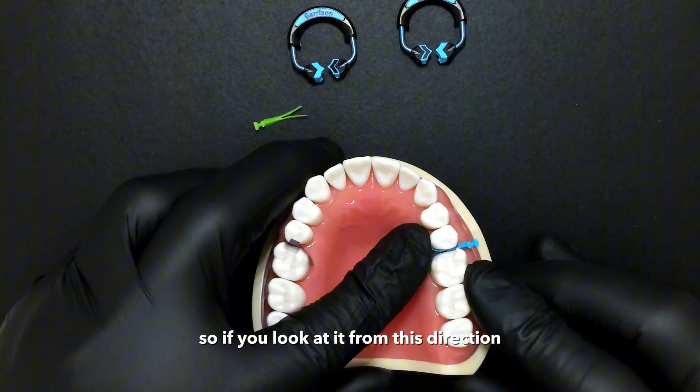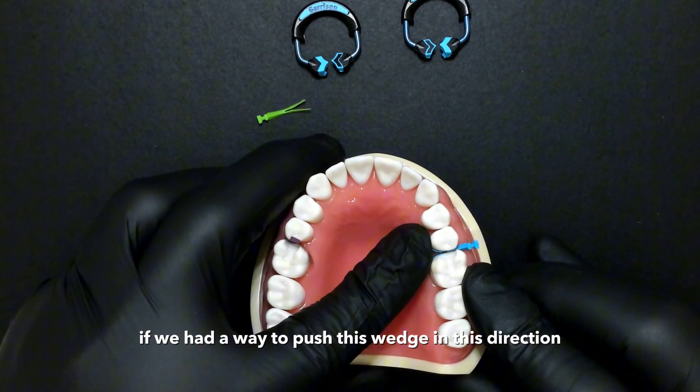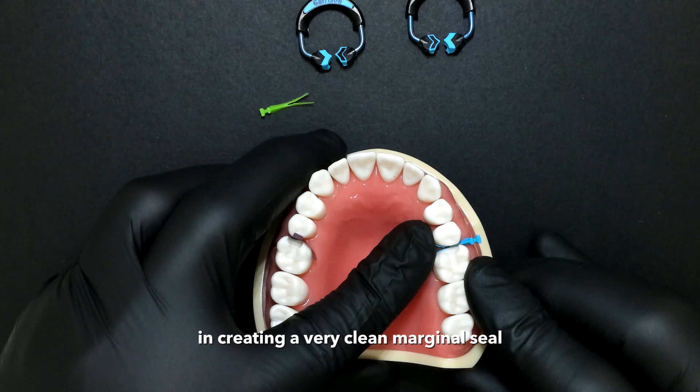So if you look at it from this direction, when I'm just pushing my finger against it — if we had a way to push this wedge in this direction — it's going to be pulling your matrix band against both teeth and creating a very clean marginal seal.